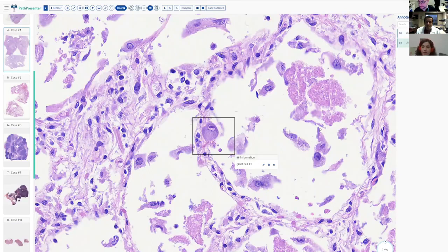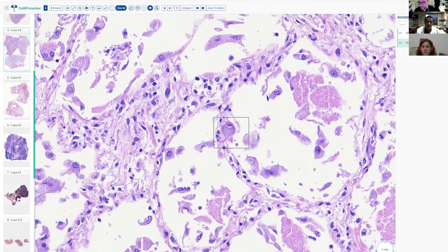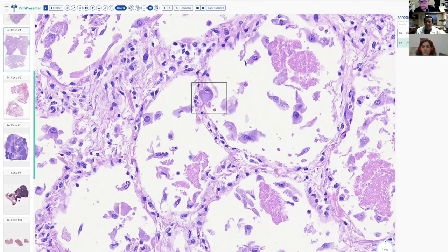Is this an AIDS case? I'm not sure of the specific history of it. It's from a teaching collection I have. Yeah, but it almost certainly will be, right? Yeah, there are very, very few other settings in which you get this degree of immunosuppression, where you get multiple infections.